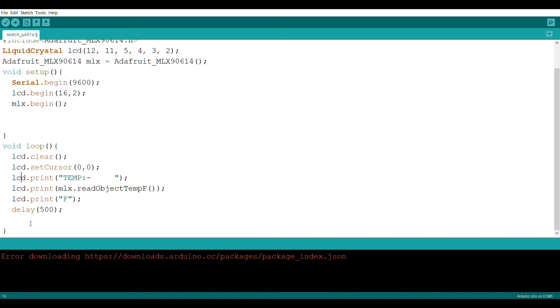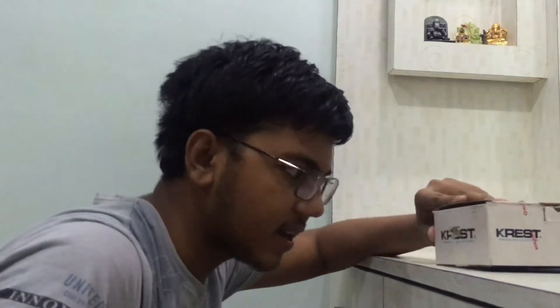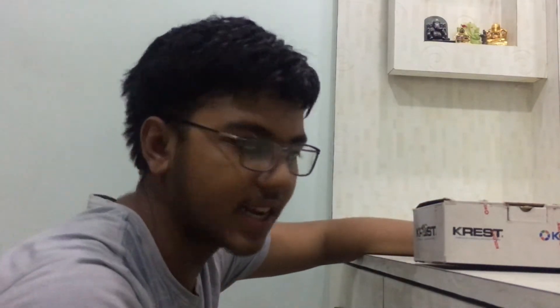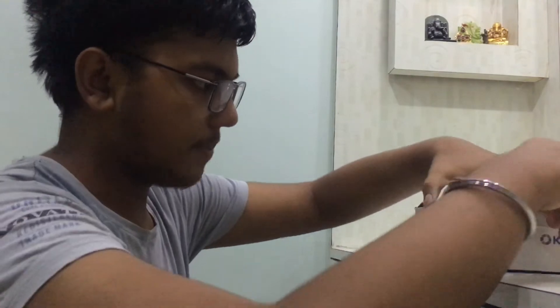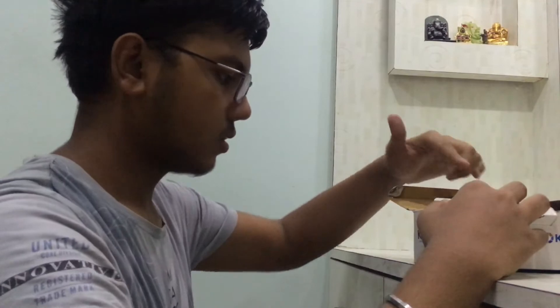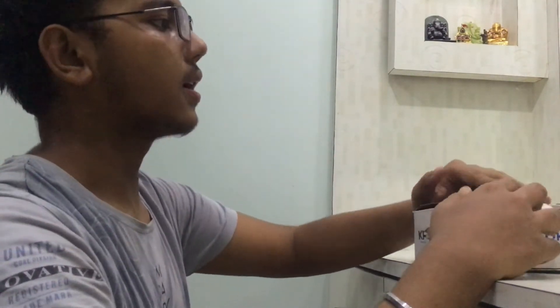Now we test body temperature. We switch on the screen and the device is running. This is our infrared temperature gun — you can see it here. I am checking the temperature reading. The power bank is on — just one minute.